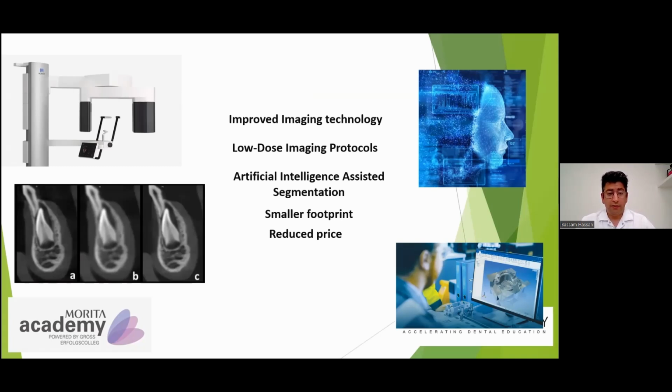So intraoral scanners maintained more or less a similar price range for the past 15 years. I mean, they go like 20, 25, 30. If it's bad, 12. If it's good, it's 35. But they were in that range all the time. Cone beam CTs, no. They were like 200,000, 250, serious numbers you're talking about.